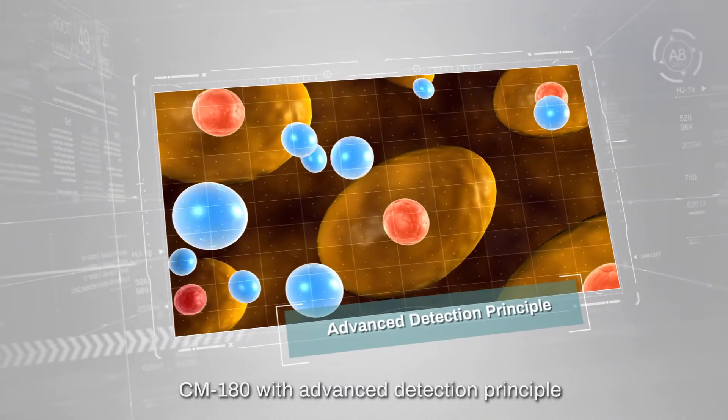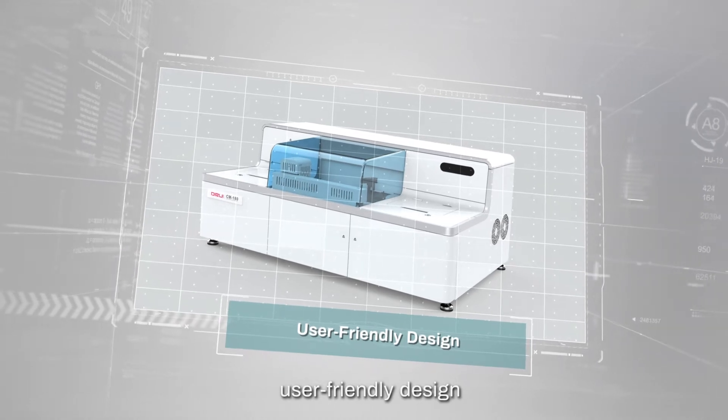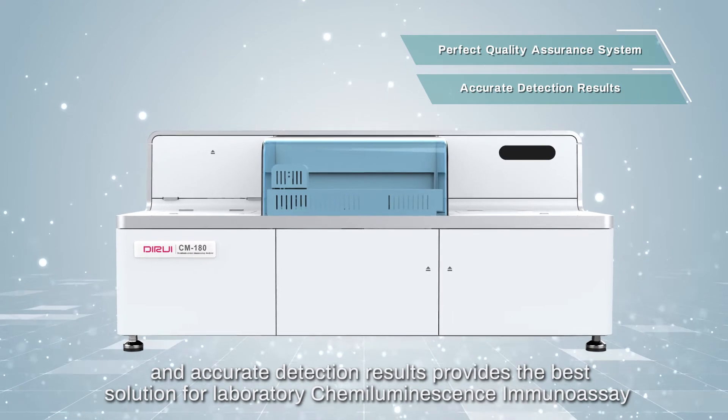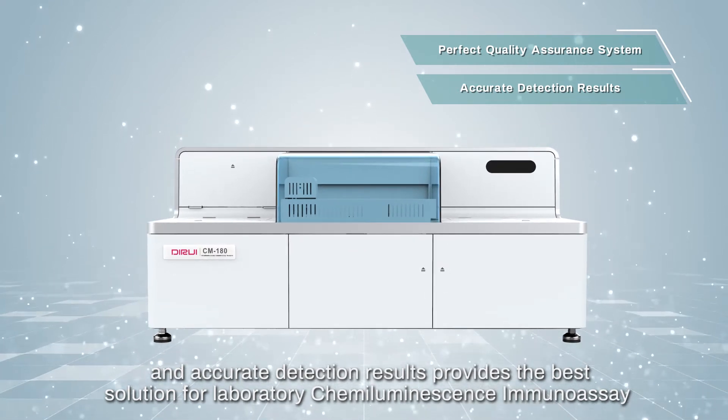CM180 features an advanced detection principle, excellent performance, user-friendly design, comprehensive testing items, and a perfect quality assurance system, providing accurate detection results and the best solution for laboratory chemiluminescence immunoassay.